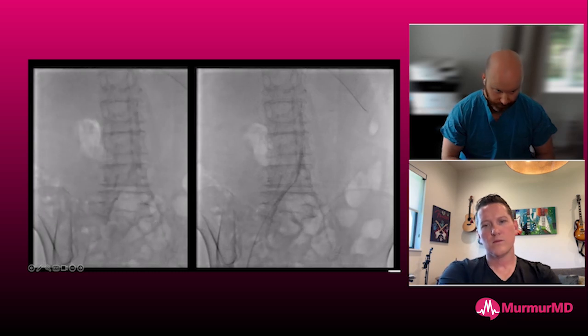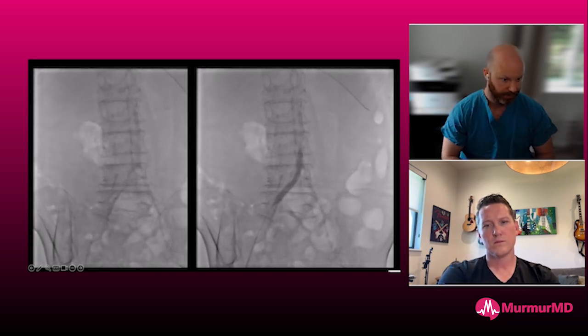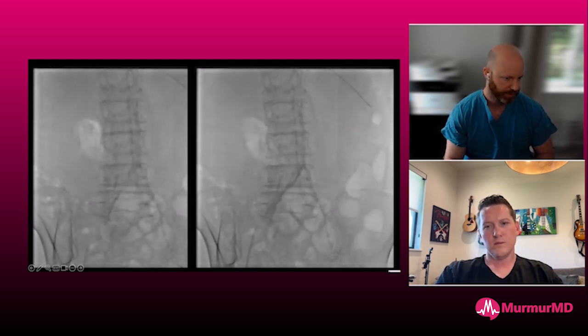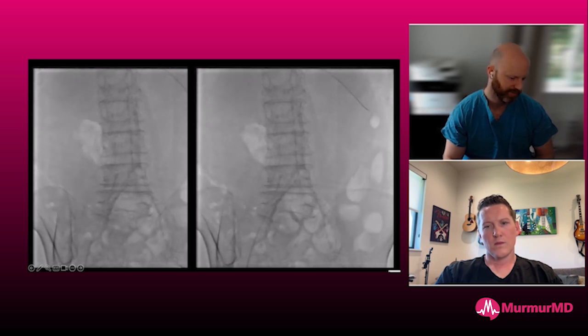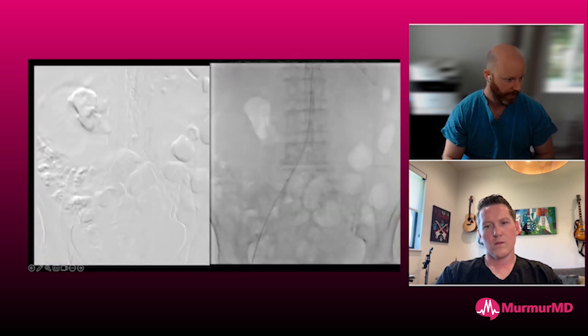We performed lithotripsy and a regular balloon angioplasty. You can see the lithotripsy balloon here on the right. We get very good expansion over the first 60 pulses. This is actually the second run. So we push the balloon forward, do the next 30 pulses, and we get really good expansion. So we feel like we're going to get adequate ability to dilate and pass our catheters.